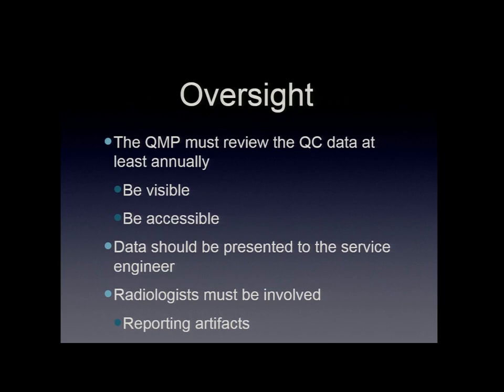So there is qualified medical physicist oversight. We should be involved more. We need to be visible and accessible. We are. I mean, my phone goes off all the time. I'm surprised it hasn't been going off this weekend, but they really call us and we answer. That's one thing that we do. We do answer, or it's converted to someone who will answer. Because that's one of the things you want, to have us accessible so that if there are problems, they have a qualified medical physicist that will give them guidance on how they should correct it.